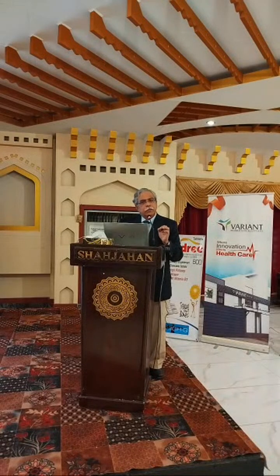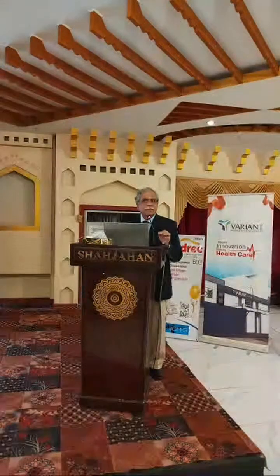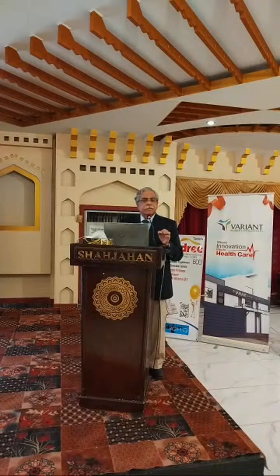So the ductus venosus is a very, very important vessel. You should know how to identify it, and you should be familiar with its Doppler characteristics. It is not an easy vessel. The fetus is usually not cooperative. The fetus needs to be either facing you or facing backwards. You can look at the ductus venosus in either a longitudinal section or a cross section, and you should be able to identify it.